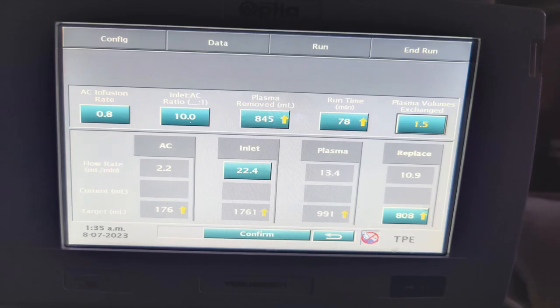Once we enter these details, we have to enter the run values of the total procedure. We will be doing a 1.5 plasma volume exchange in this patient. Once that is confirmed, the steps of custom priming will begin.